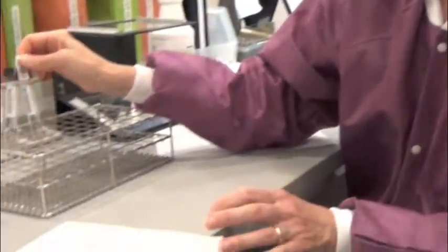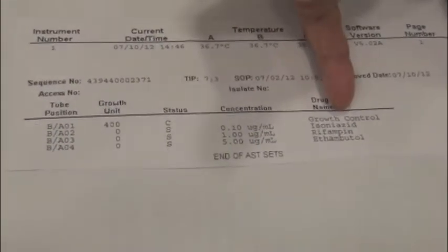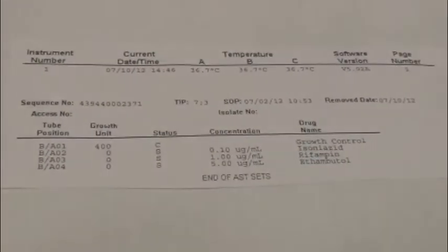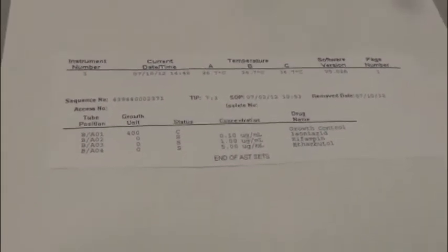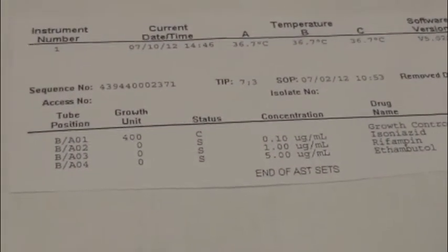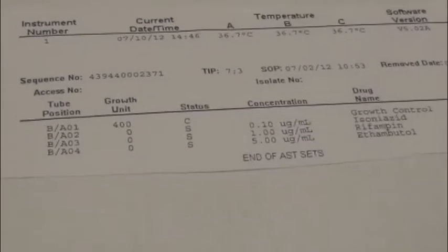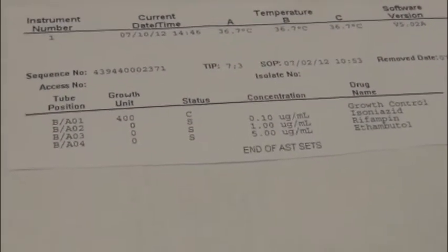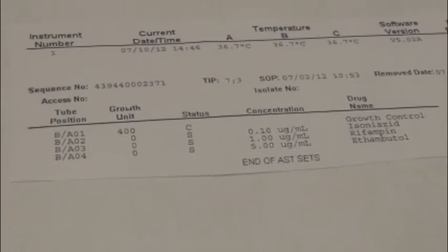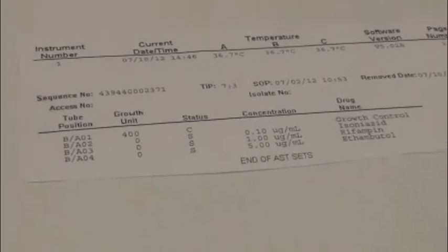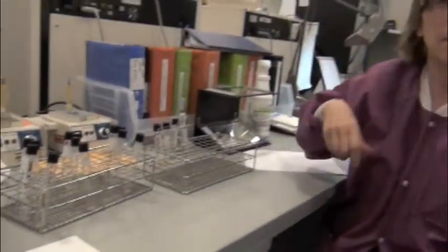This is an example of the printout that we will get. This is the control, the growth control, and these are growth units. The MGIT system reads fluorescence and converts it to growth units. And you can see for each of the drug units, this is the control that we use, the mycobacterium 27294. You can see it is sensitive to all three of the critical concentrations of the drugs, and that is what it should be. We always run controls when we run TB susceptibility testing. If there is any thought that we have contamination, then we would repeat it.